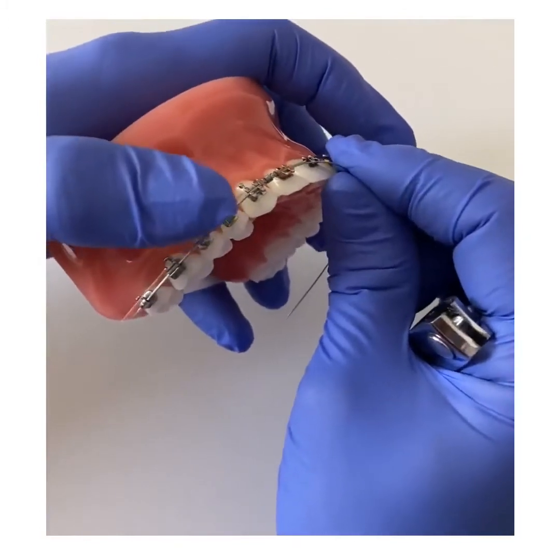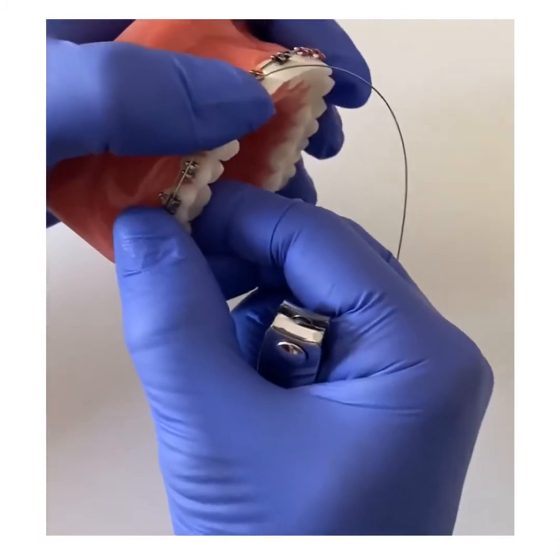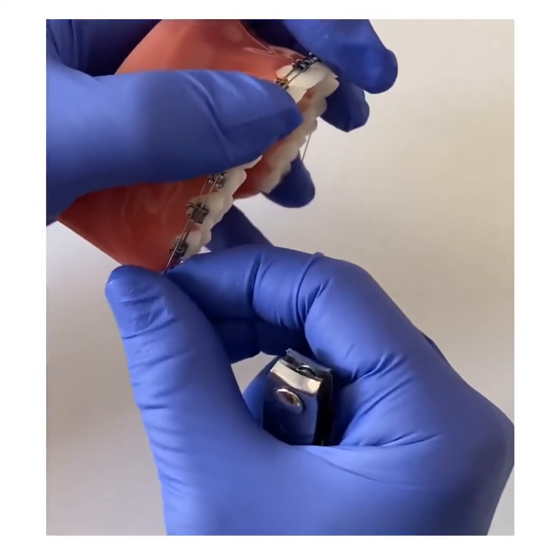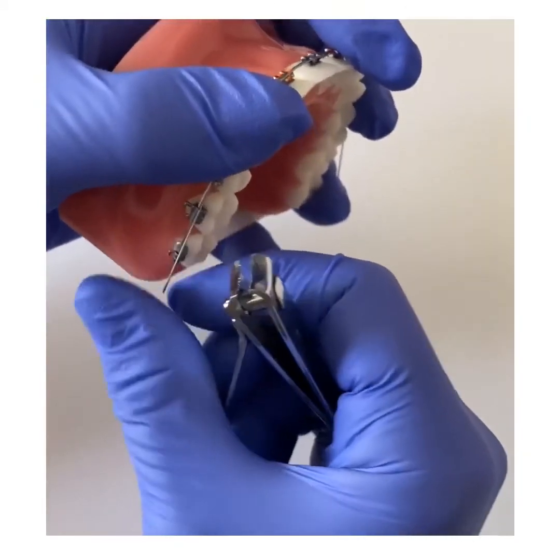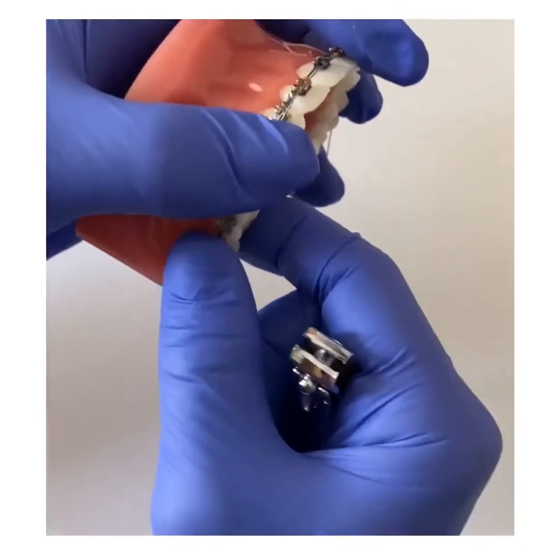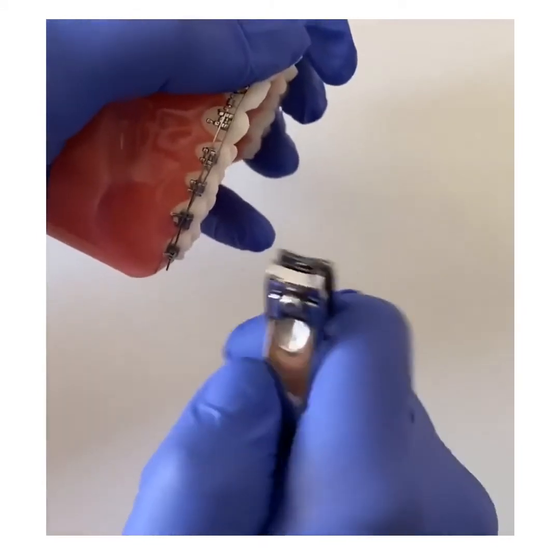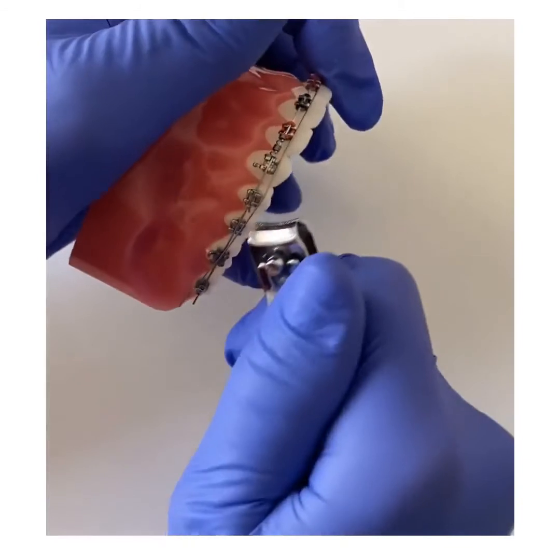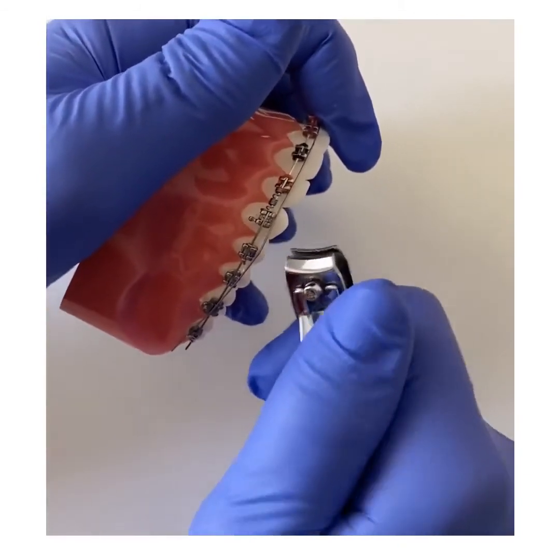This technique can really only be done in the beginning stages of your treatment when you're in softer, lighter wires. As you go through your treatment, your wires tend to get thicker and this technique would definitely not work. So if you're in the beginning stages of your treatment and you find your wire is long and poking, you want to find a clear, comfortable spot closer to the front of the mouth — not towards the back. We're going to find a place in between two braces closer to the front of the mouth.